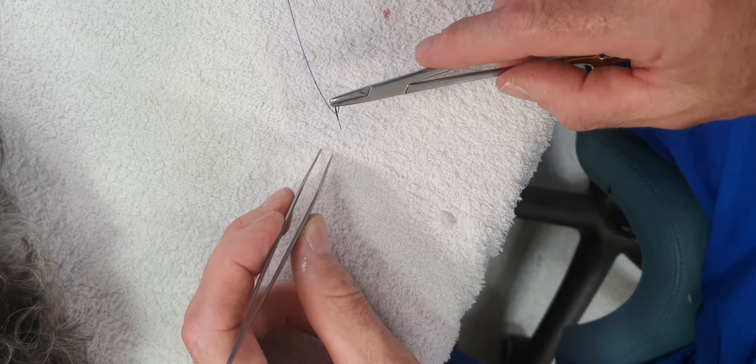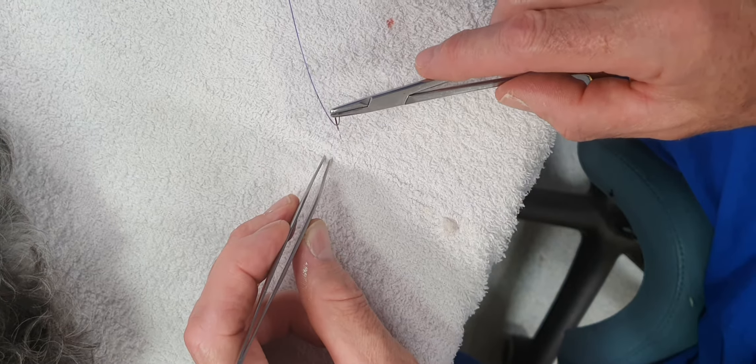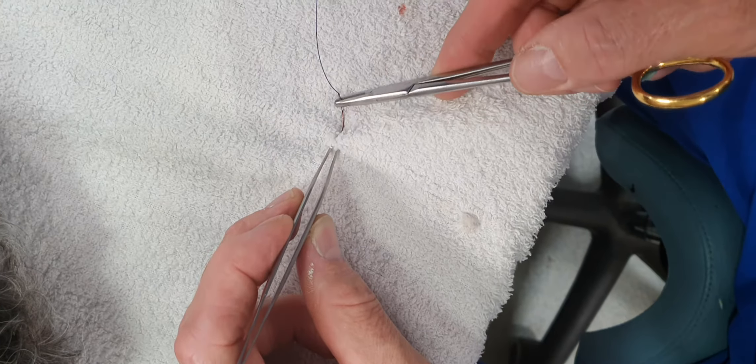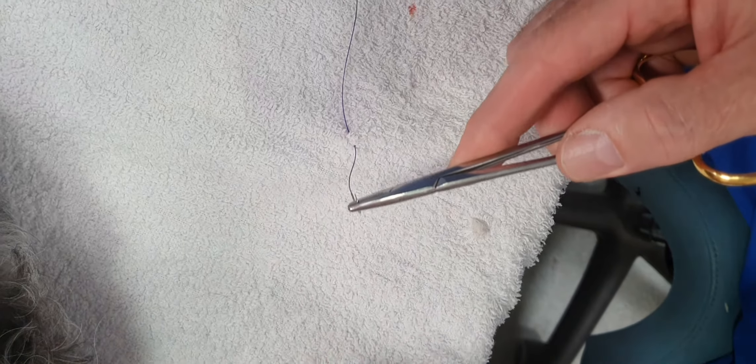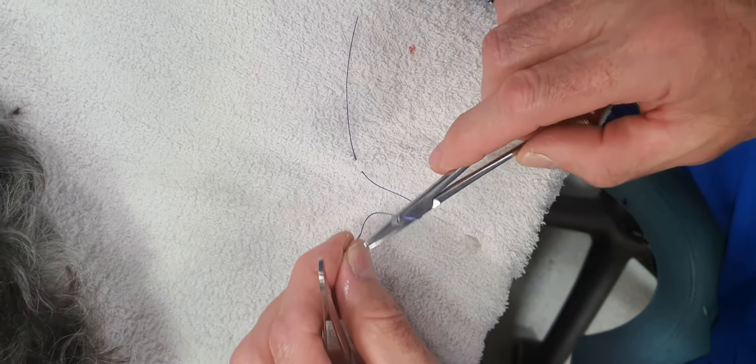Hi guys, as promised, this is a demonstration of a general GIT suture. Basically, it is a slip knot that allows you to very precisely control the tension of the suture. The first throw is performed as normal.